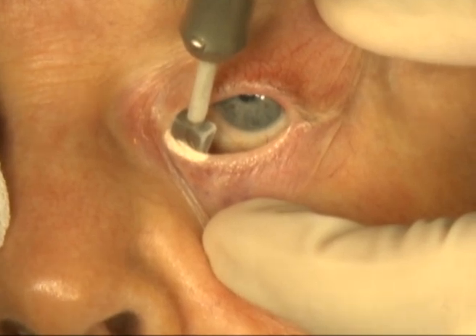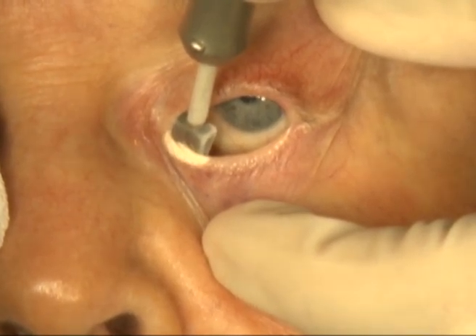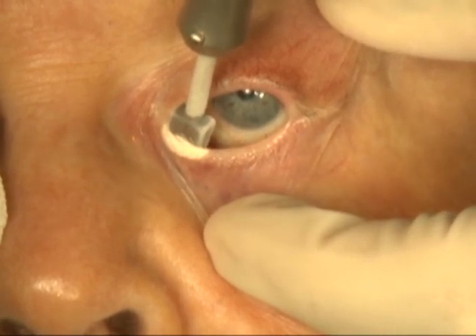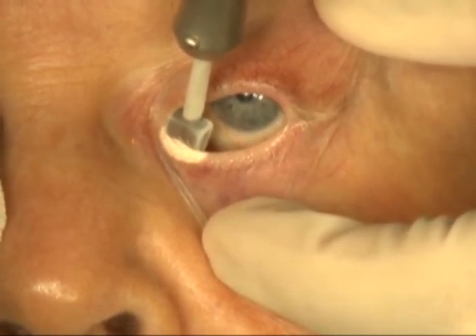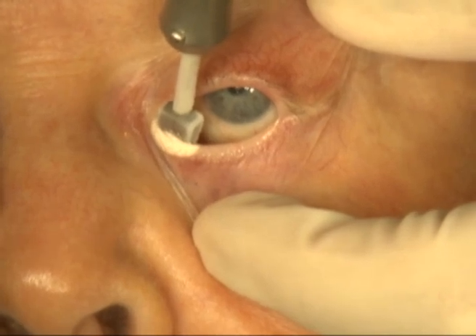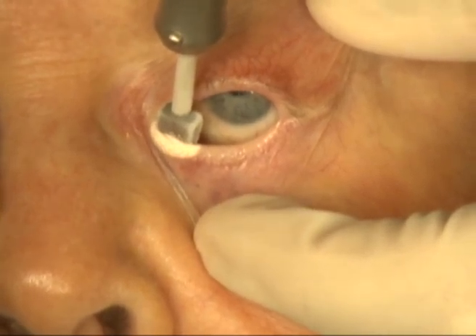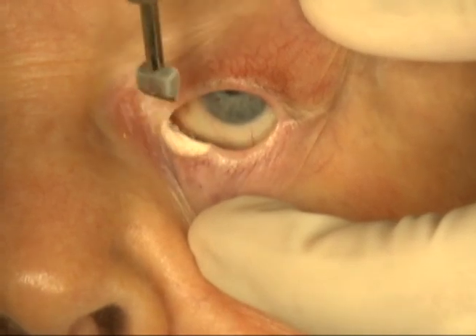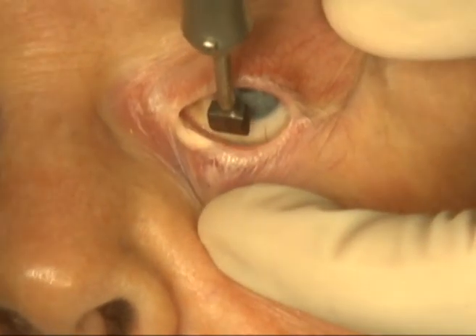In the destruction of lashes of the lower lid, a freezing should be performed for approximately 25 seconds. This is then allowed to thaw and the probe is placed along the area next to it.